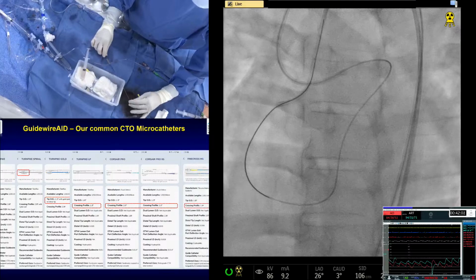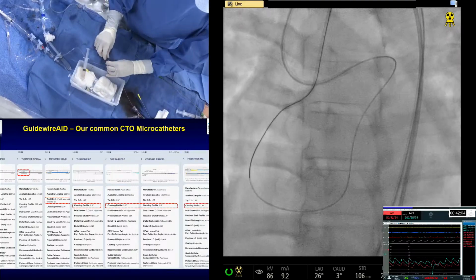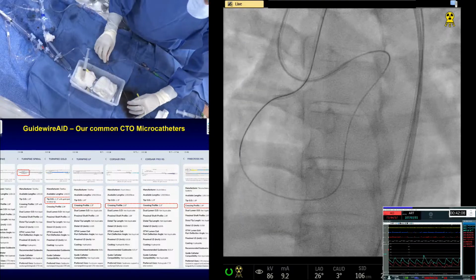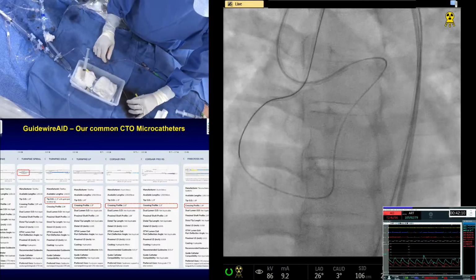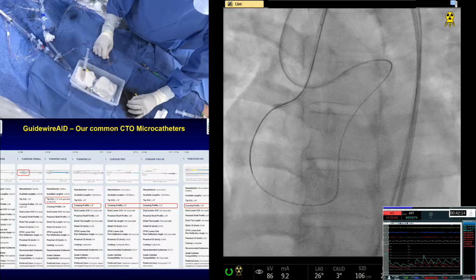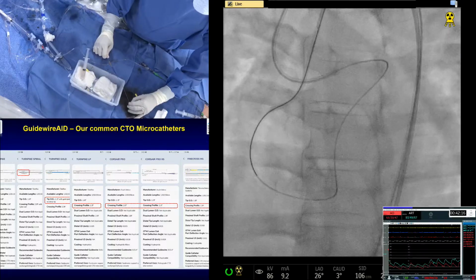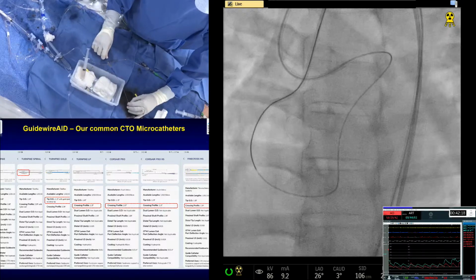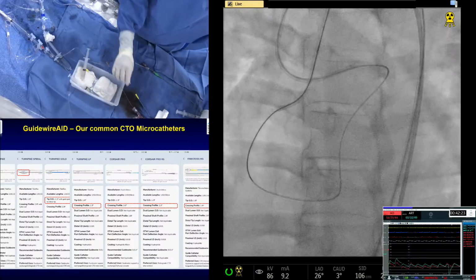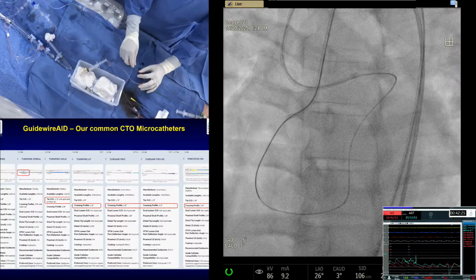You know what? I want to go a little bit further up. Yeah, pull back the balloon then. You have to pull the balloon back. Go up again. Yeah. Now go. Good. Okay, that's it already. Deflate. Now we can remove this.